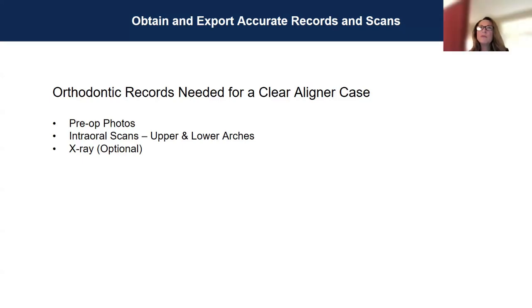No, they're probably saying that for their treatment plan. Oh, okay. So each aligner company has its own protocols, so you would have to find out from them. I do know that with Invisalign, you can send a PVS, but they want you to have the PVS taken with their own Invisalign impression trays. Other ones, you can use your own impression tray, but most of them are PVS and they scan it in.